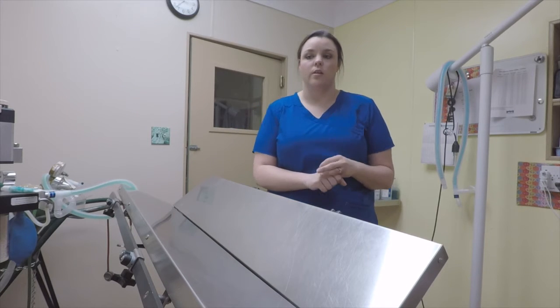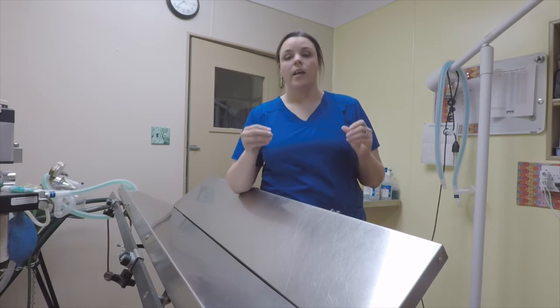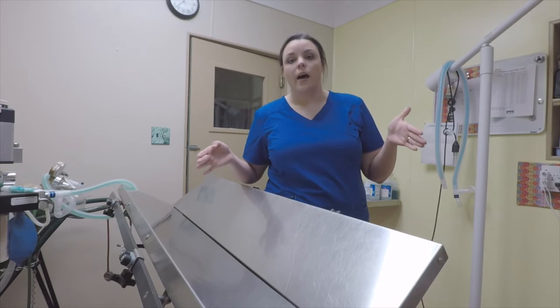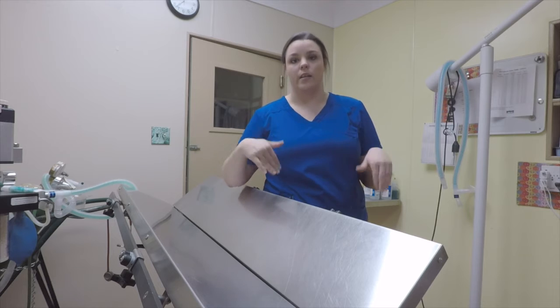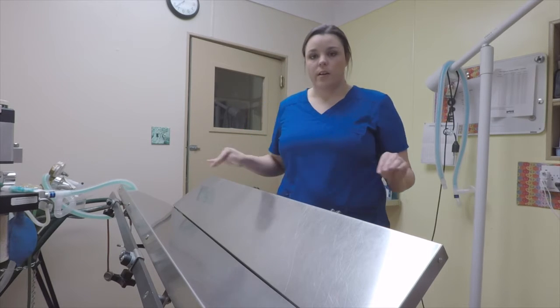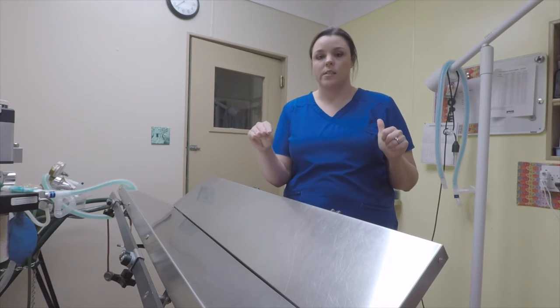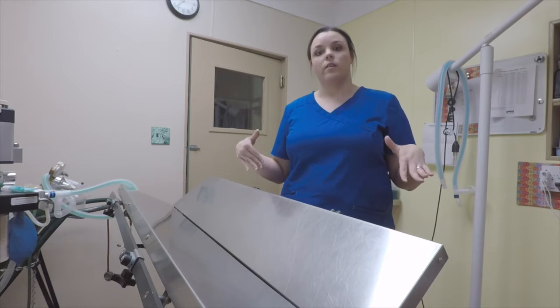You want to make sure that you have a specific set of cleaner in the surgery suite and do not take it anywhere else. That way it stays in the surgery suite and you're not bringing in something else. You'll want to wipe down everything, the tables, the trays that they use, the anesthetic machine, everything, even the floors. That way you minimize the dust in the room and the bacteria.